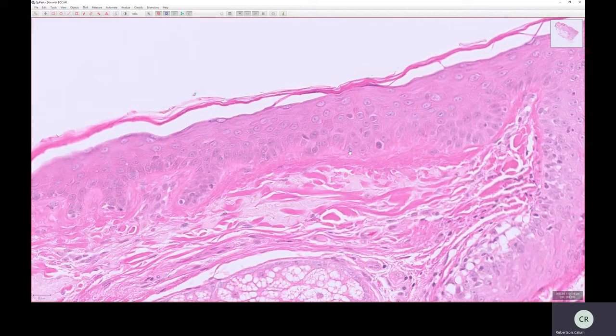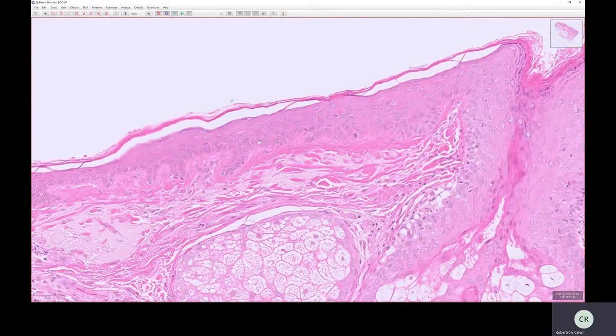So along the bottom here, you've got the basal layer, and these are the cells that are replicating. We're going to go into this in more detail later, but these are the cells that are replicating, and they mature upwards, and slowly the nuclei die off, and here you can see in purple the keratohyalin granules, which form the basis for the keratin that you can see on the surface here. And that's happening all the time. These cells are replicating, maturing upwards, and getting shed off.